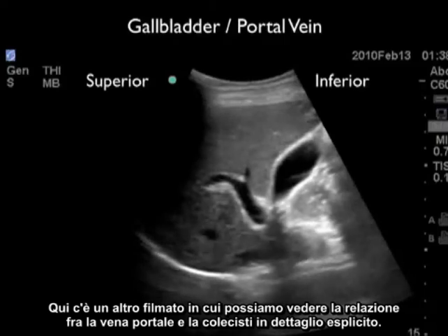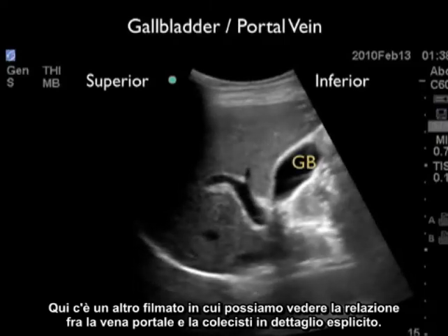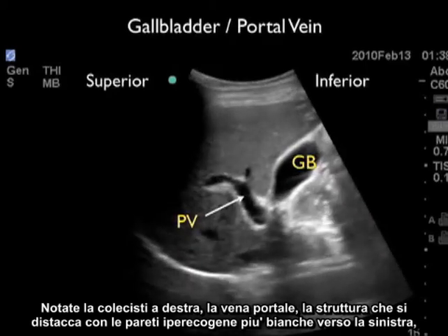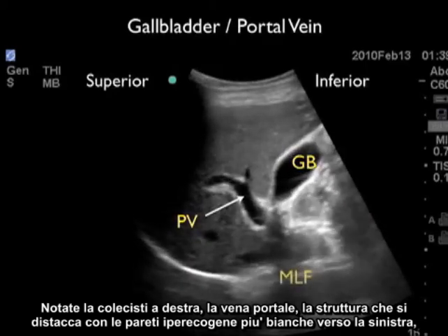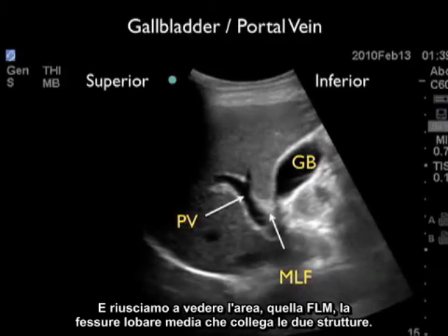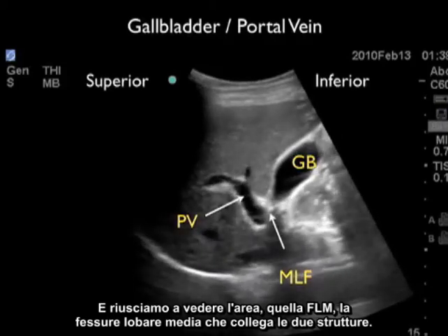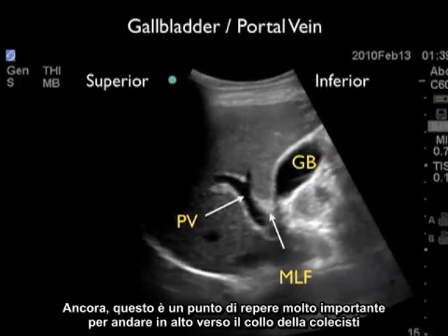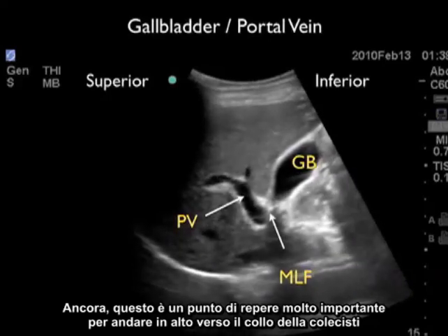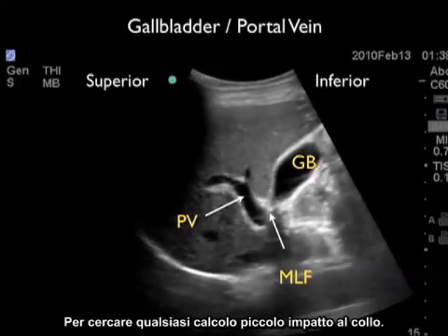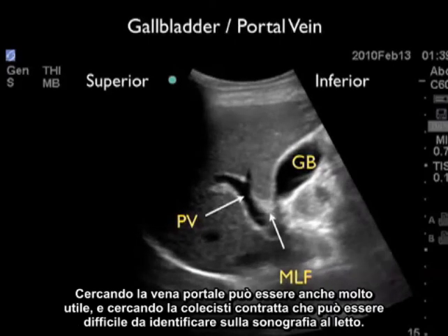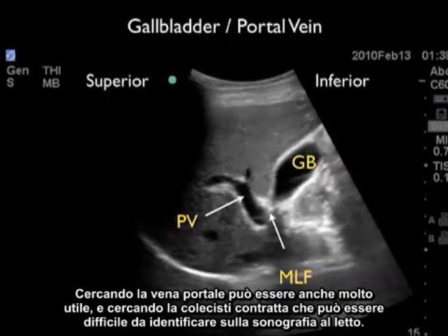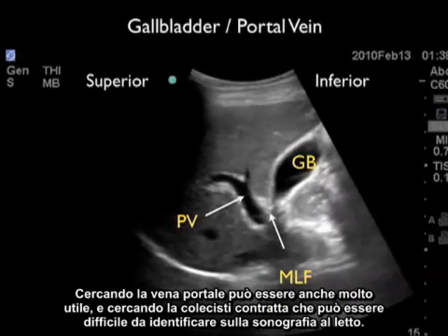Here's another video clip showing the relation of the portal vein to the gallbladder in explicit detail. Notice the gallbladder to the right, the portal vein with hyperechoic walls towards the left, and the area of the median lobar fissure connecting the two structures. This is a very important landmark for walking up to the neck of the gallbladder to look for small stones impacted at the neck. Also, looking for the portal vein can be helpful in identifying a contracted gallbladder that can be difficult to find on bedside sonography.